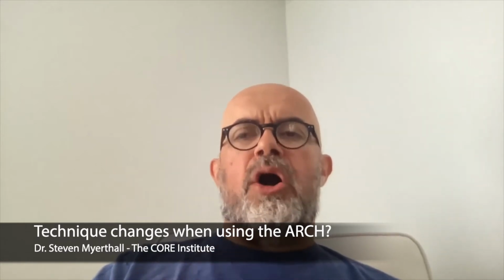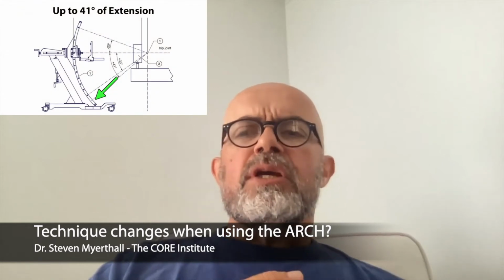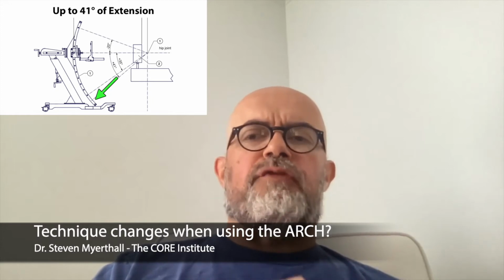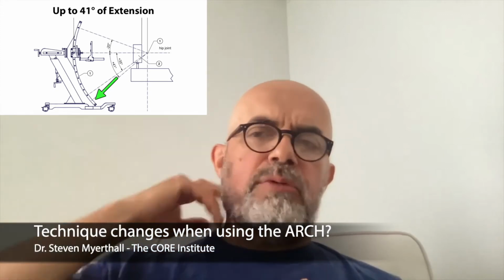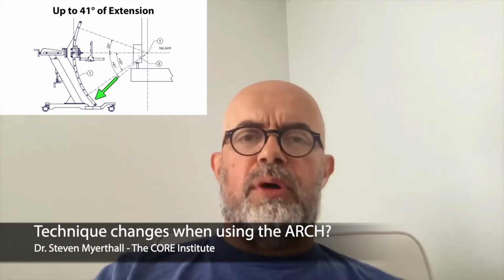The other thing that I think is easier on the arch table than the HANA table is that the length of the arm is shorter on the arch table than it is on the HANA table. So sometimes on the HANA table, you have to drop the leg all the way to the floor, but the foot's not at the floor yet because the extension that goes as part of the table beyond where the foot is attached has touched the floor.